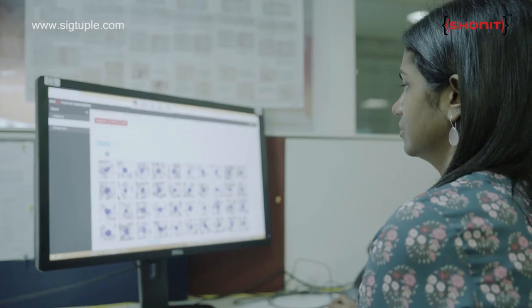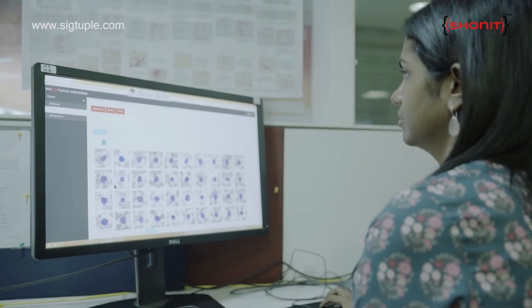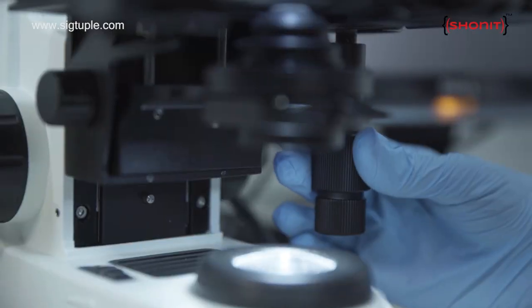A cell counter provides a lot of information about the various cell counts. Whereas the morphological analysis, which is absolutely critical before signing out a report, is done by Shonit.